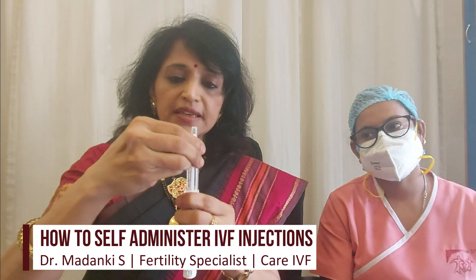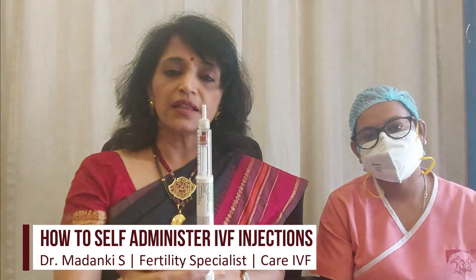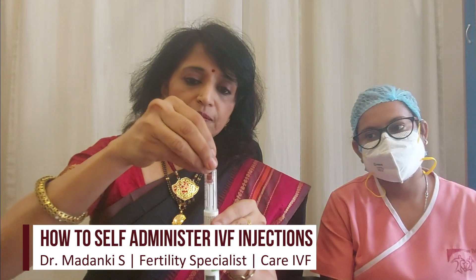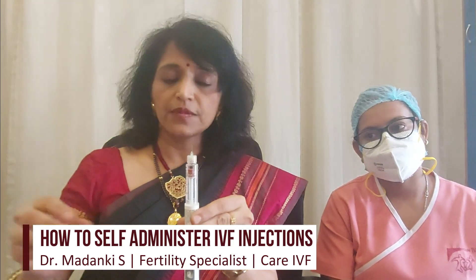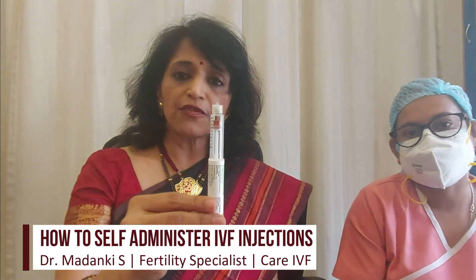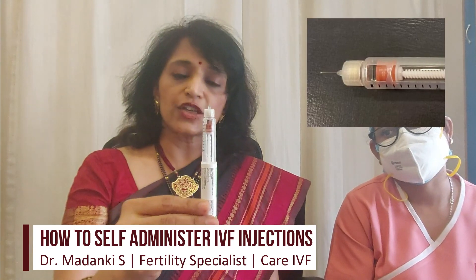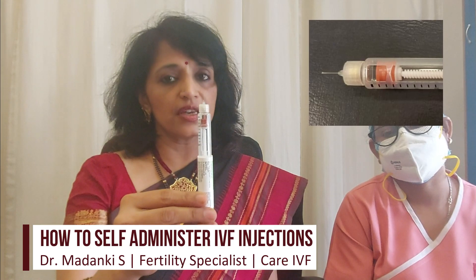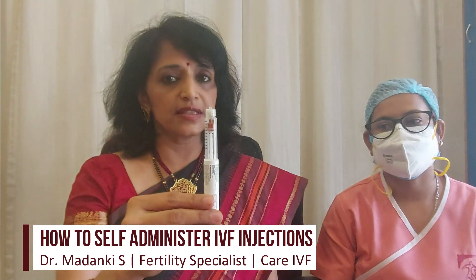Then remove the plastic cap. Inside you will see another protective sheath which also needs to be removed carefully. You can now see a very fine needle inside. Now comes the actual step of administering. The site to be administered is usually on either side of the umbilicus, leaving three fingers' distance.